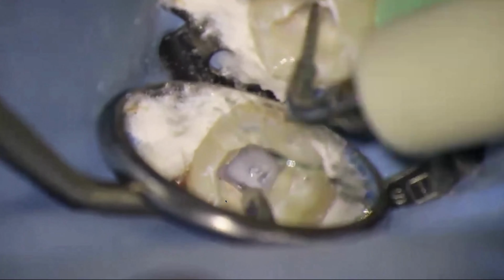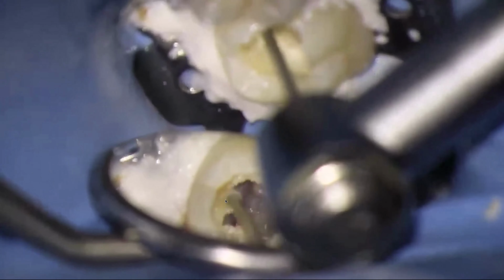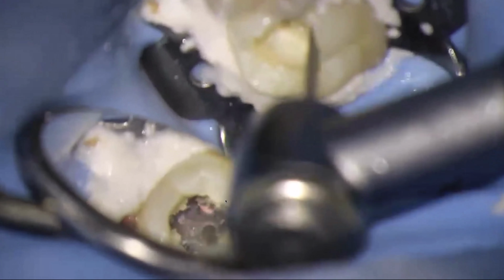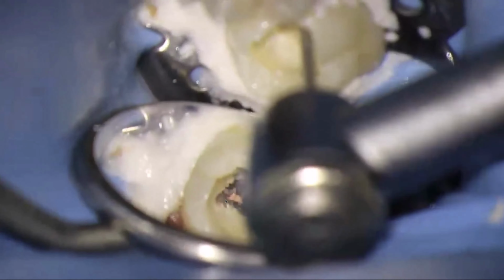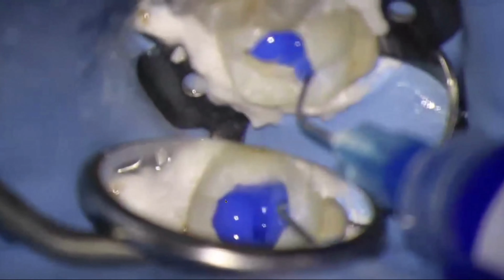So this is what I've learned over the years. When the root canal treatment is immediately completed, as I mentioned before, I use ultrasonic and water just to clean it up. And then I take a very, very large round slow speed burr and I shave, and I'm not gouging and I'm not digging into the dentin. I'm just shaving a superficial layer of dentin away with the round burr. You can probably do this with an air abrasion tool or equipment. I choose to use just a round burr. I'm not enlarging anything. I'm just freshening up the dentin.